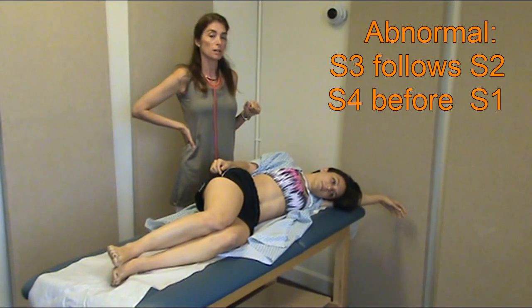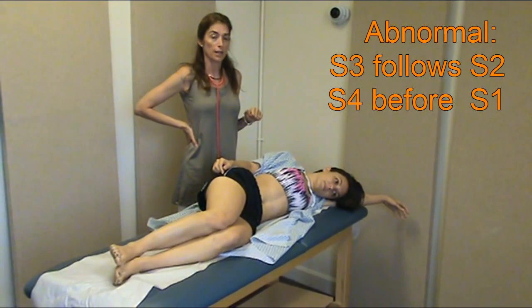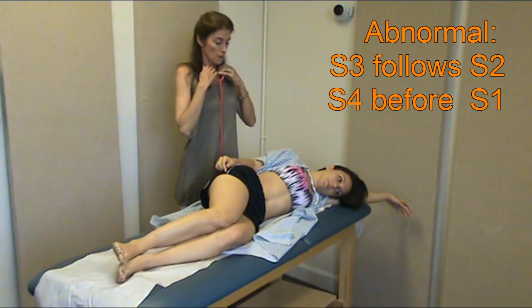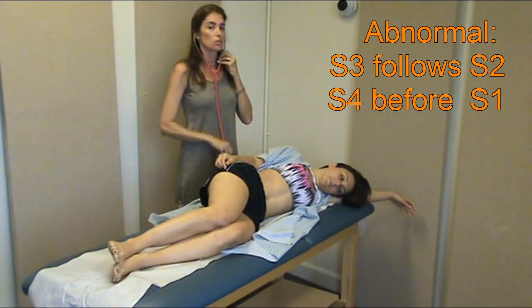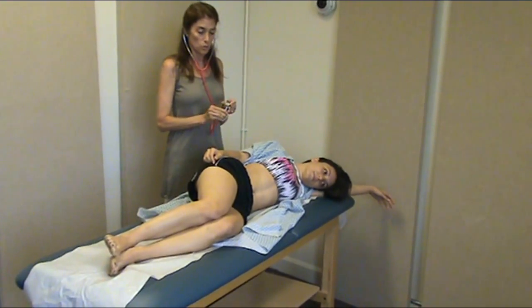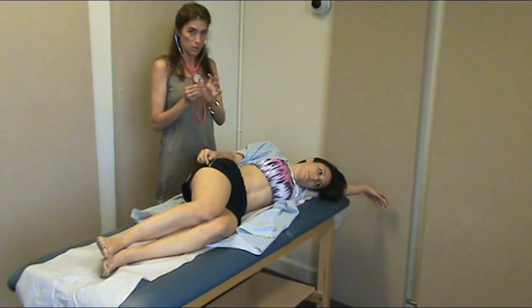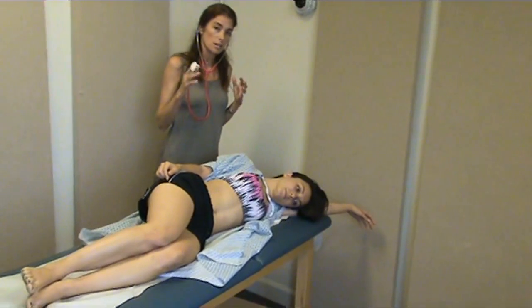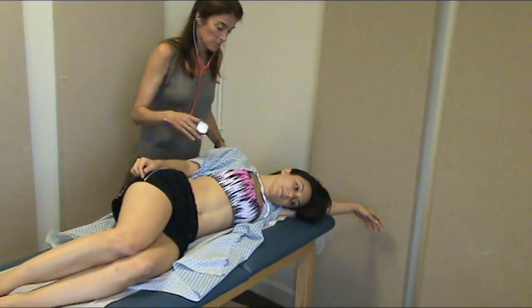S3 is going to follow S2, and S4 is going to be right before S1. When you're listening for S3 and S4, you should listen with the bell of the stethoscope. So again, you have to switch your stethoscope around and make sure that you have it correctly placed on the bell. You're going to listen to each valve once again.